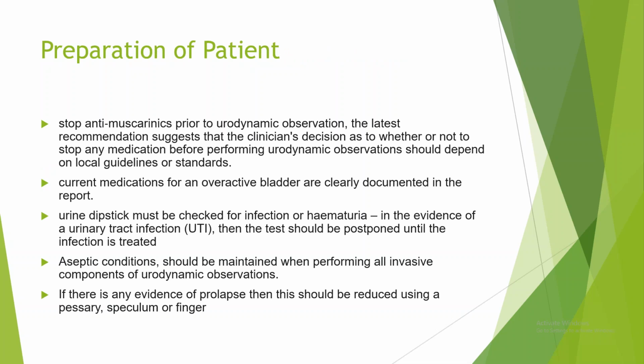Now, what should be done for the preparation of the patient? First, previously they used to tell that you have to stop any antimuscarinic prior to this urodynamic. So for urgent incontinence, the patient may be taking oxybutynin, tolterodine, darifenacin, like that. And mirabegron, that you have to stop, that they previously used to tell. But now the recent recommendation says that there is no need. It is not like no need, but the clinician should decide whether to continue or whether to stop. But it should be documented properly. Whether she is taking any antimuscarinics or drugs for overactive bladder, it should be properly documented.